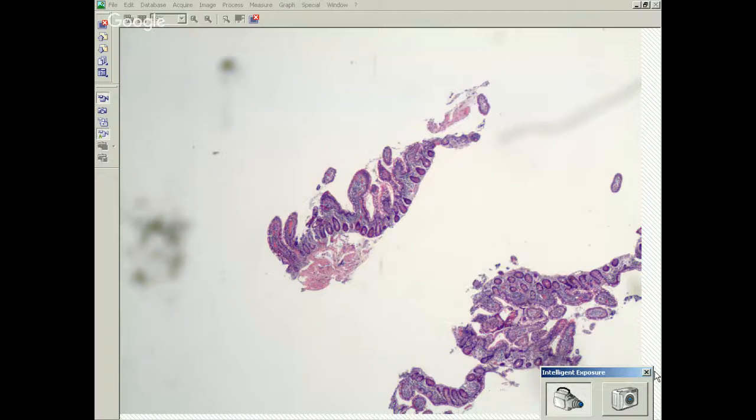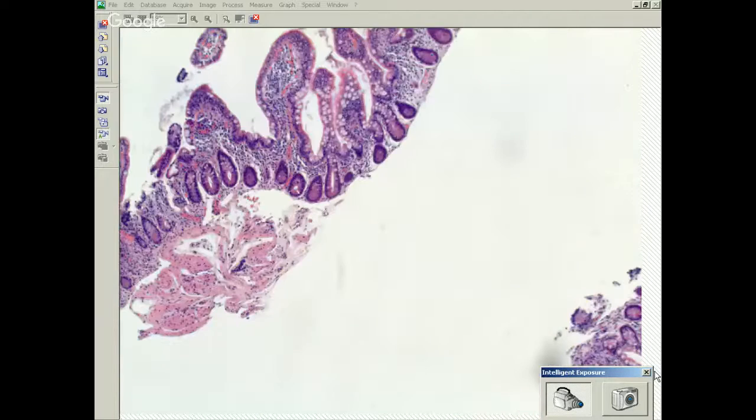Okay, so this is a 27-year-old male with a change in bowel habits and lower abdominal pain. This is actually labeled as ileum, which is an interesting location for this, but let's go on.